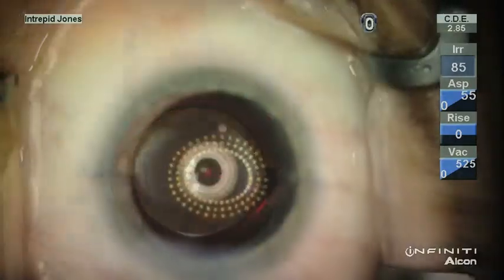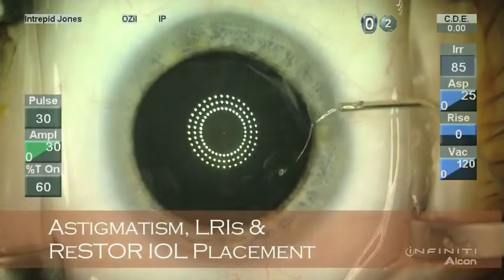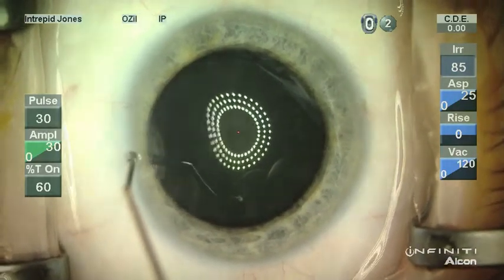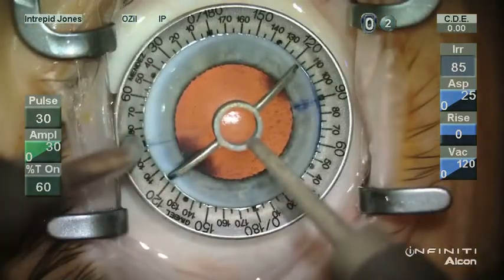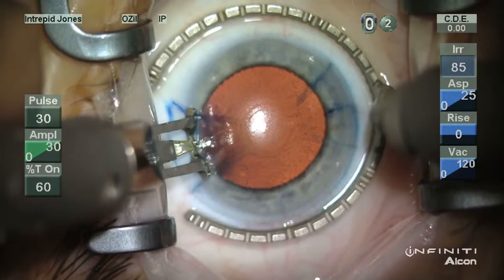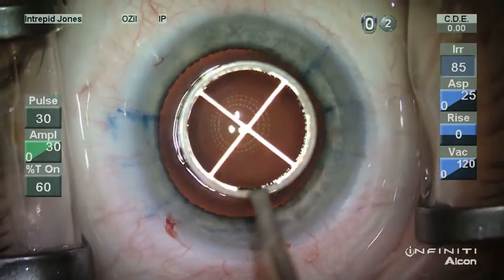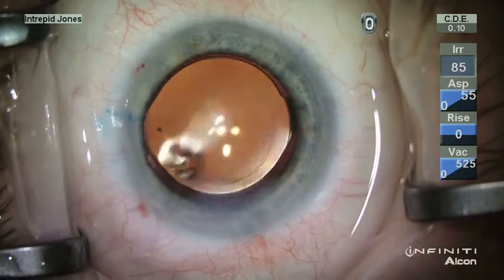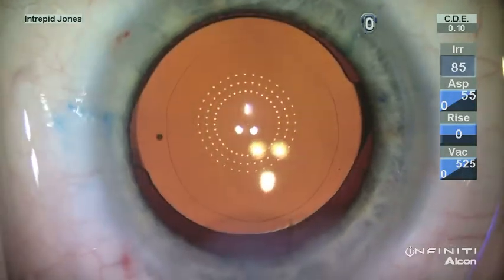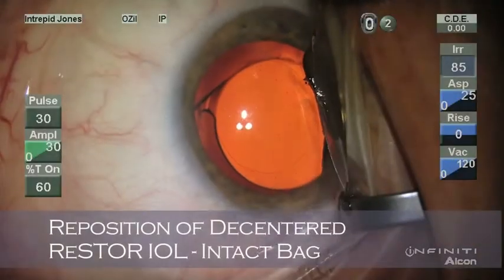And most importantly, at the conclusion of surgery, one can verify that you have a correct orientation of the lens by comparing the astigmatic correction of the lens versus the corneal reflection. This patient has approximately two diopters of astigmatism and desires presbyopic correction, and therefore paired 55-degree arcs are utilized to relax this preexisting corneal astigmatism. It's helpful to note here the round configuration of the corneal reflex of the keratoscope indicating good correction of the astigmatism. At the conclusion of the case, you can use the keratoscopic rings and the concentric nature of the diffractive grading to create a very precise alignment of the lens to the visual axis.